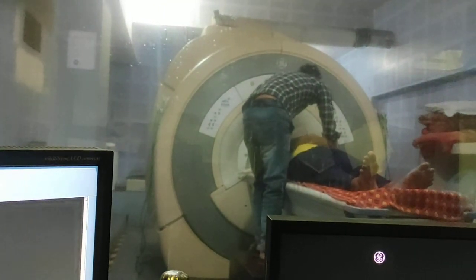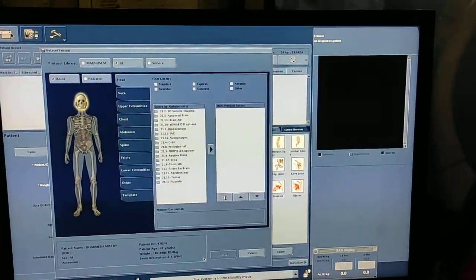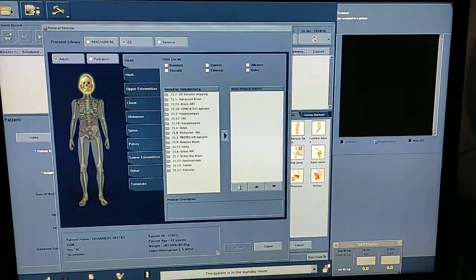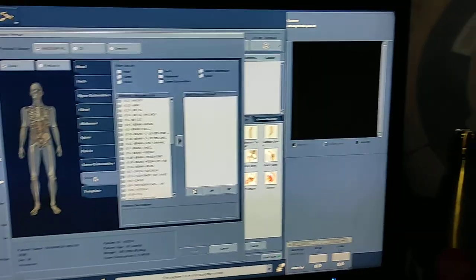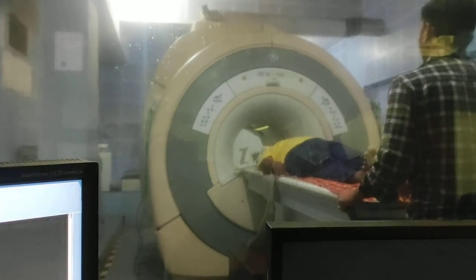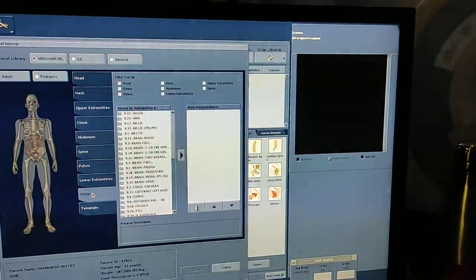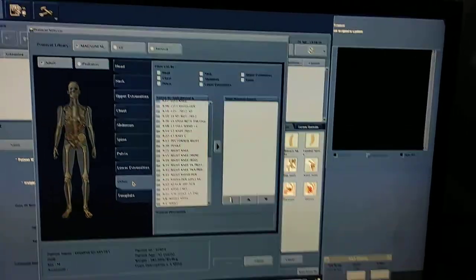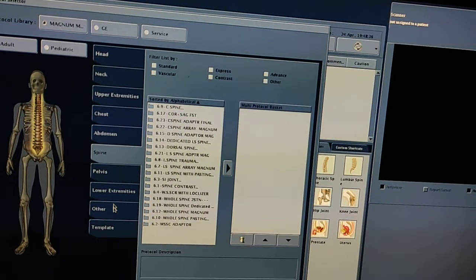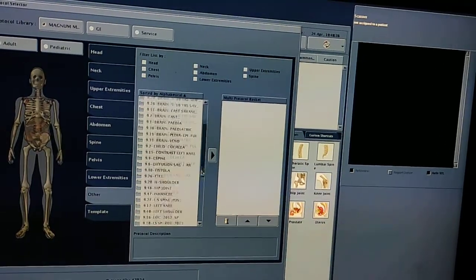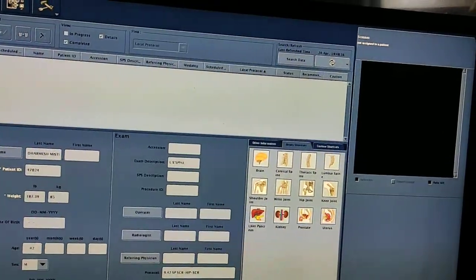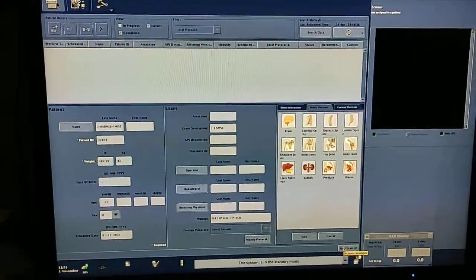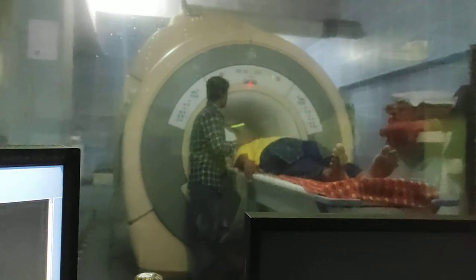Before doing any spine scan, you have to screen the whole spine for counting purposes. For whole spine screening, the position is head first. You have to lie the patient down on the bed in a straight position so that we will get a proper spinal cord in a single image. I have kept my personal protocols; this is my lumbar spine protocol. In the GE system, we are taking whole spine without a scanogram, so you have to give the proper position first.